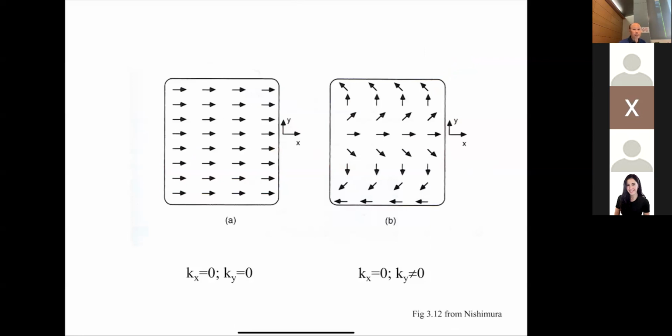Okay, so let's keep building up our intuition about what it means to be at different points in K-space and what the spin patterns look like. At Kx equals 0, Ky equals 0, that just means there's no variation in phase, either in the X or Y direction. So this is typically the starting point for most MR experiments. We tip all the spins, and at time equals 0, they're all in phase, all right? So that's where we start off.